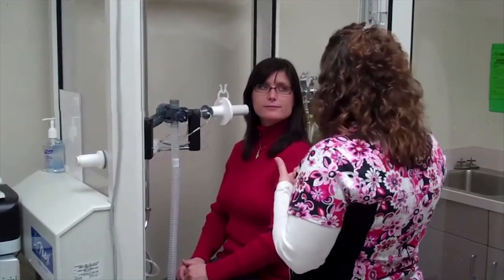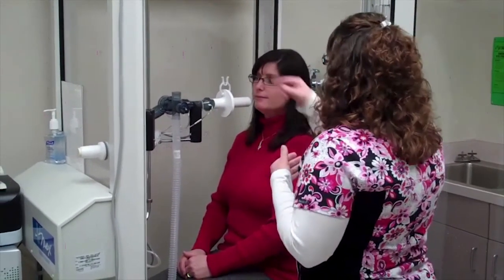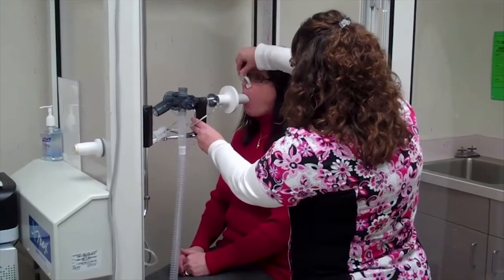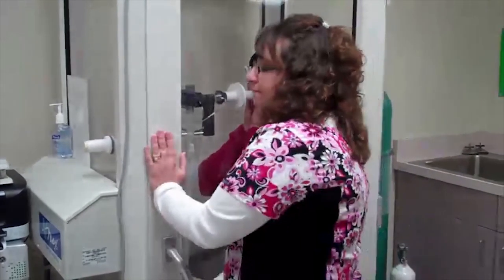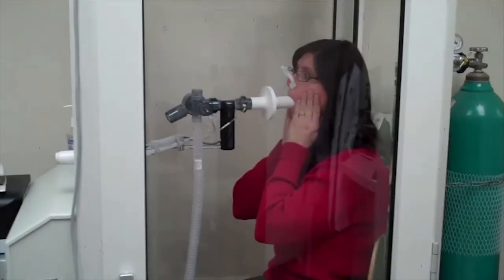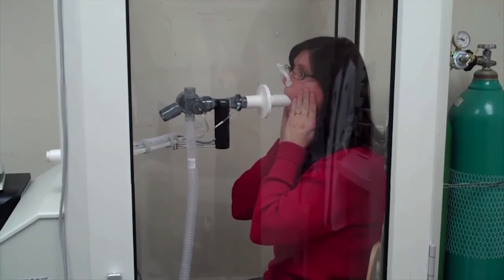While you're panting, you're going to meet a restriction. That's part of the test. I want you to keep panting through it, okay? I will talk to you over the intercom. Go ahead and put your mouth on. Nice, tight seal. For this test, I need your hands on your cheeks. Okay, nice, normal breathing.